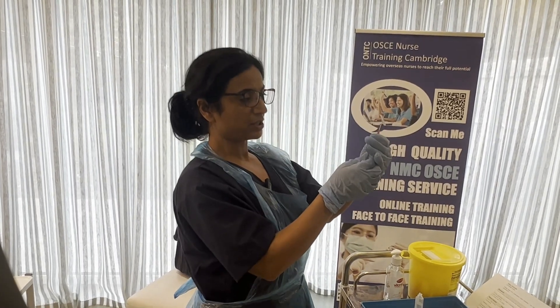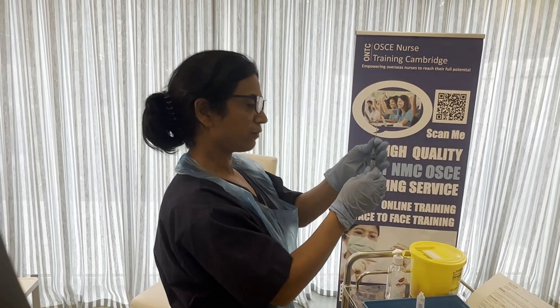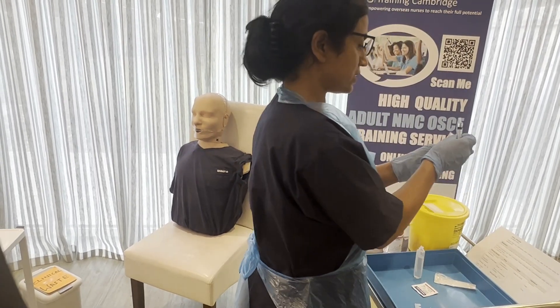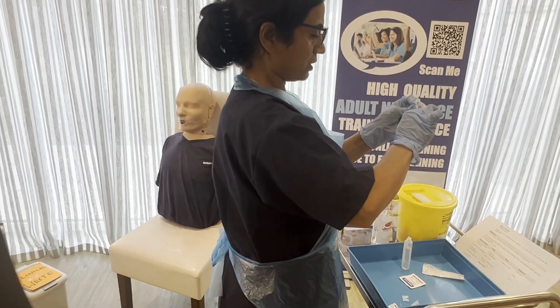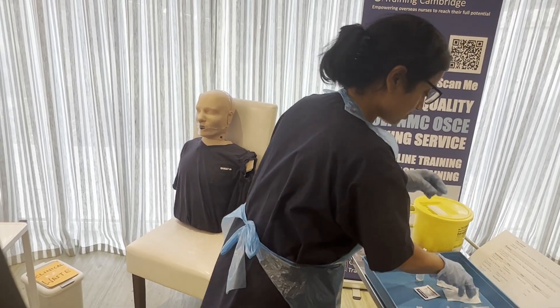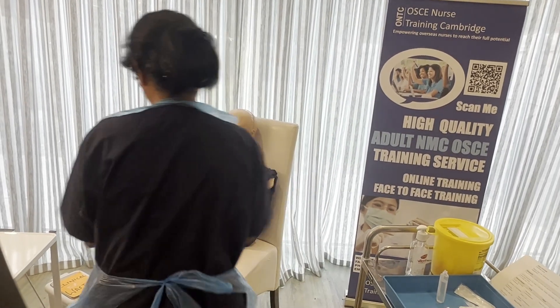Now I'll clearly tell the examiner: I will not be touching the top of the needle — I'll pick it from the base carefully and put it straight into the sharp bin. Then I'll apply the giving needle using non-touch technique, put it on firmly, and keep it ready in my tray.